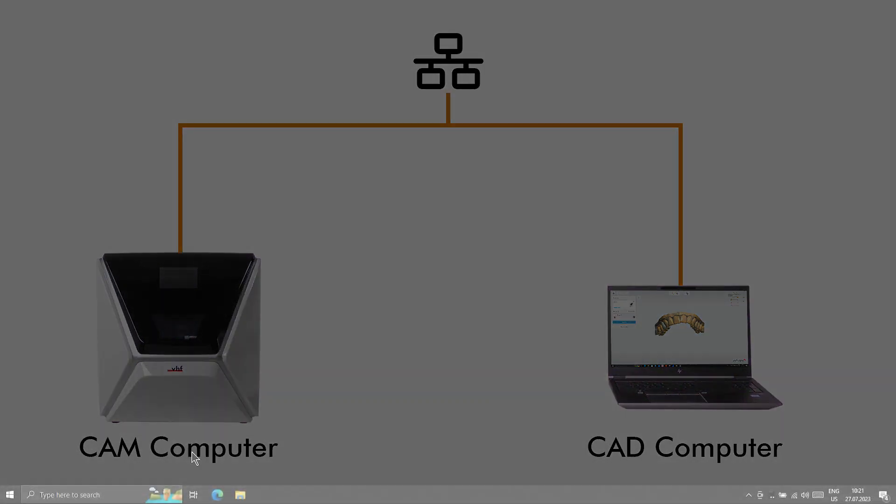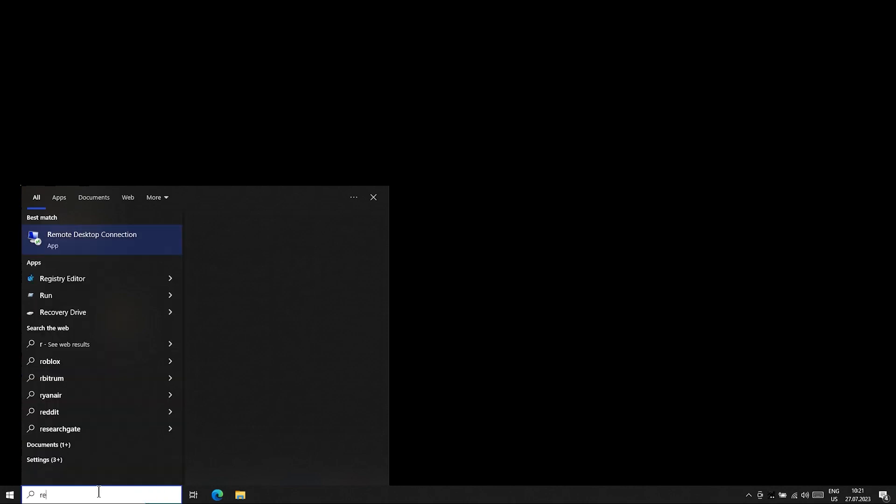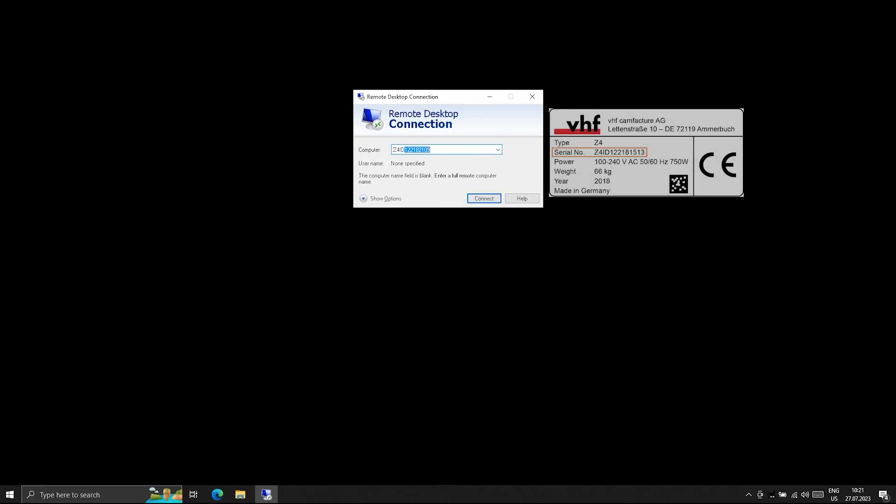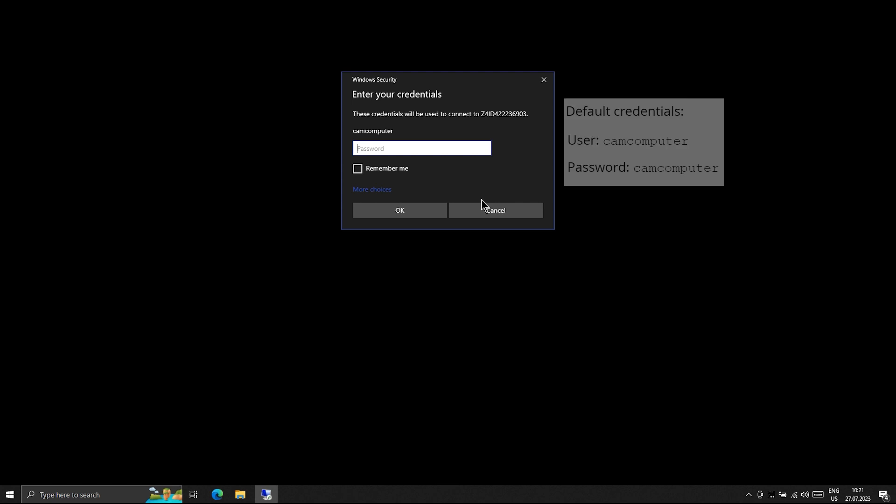To do this, press the Windows key on the CAD computer, enter Remote Desktop Connection, and select the corresponding application. Enter the serial number of the Z4 in the Computer Combo box and select Connect. Enter your CAM computer login credentials.